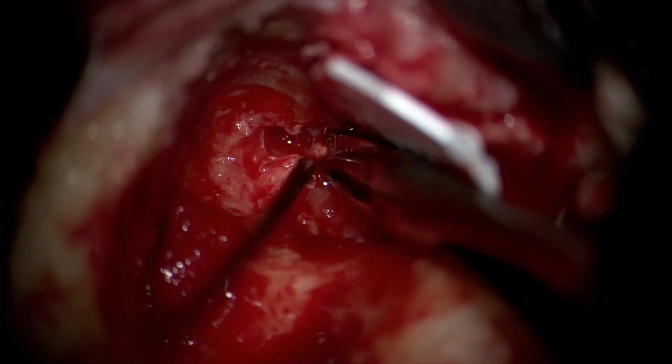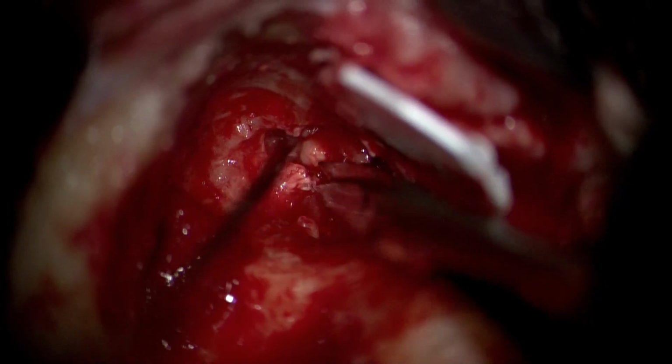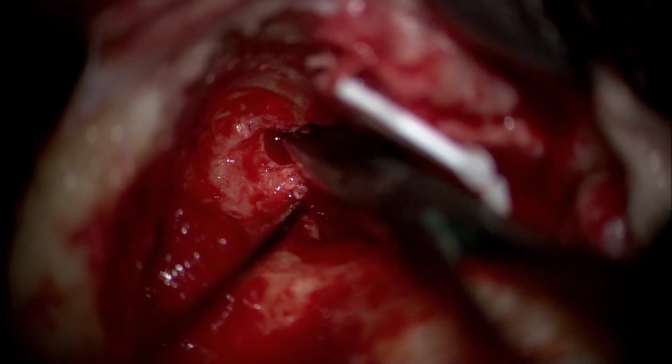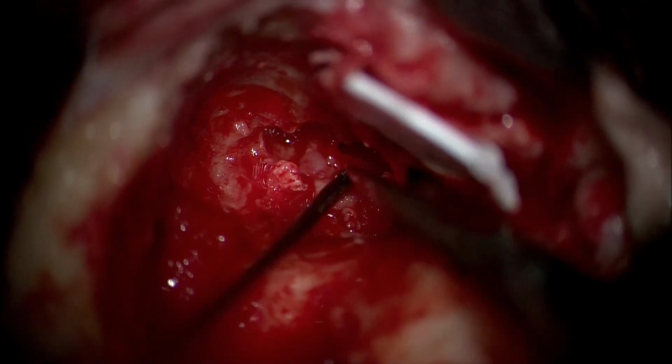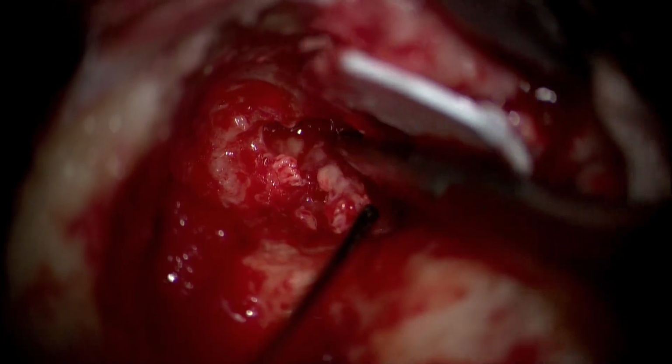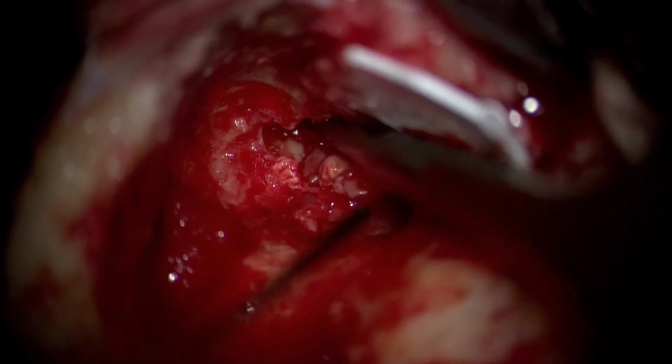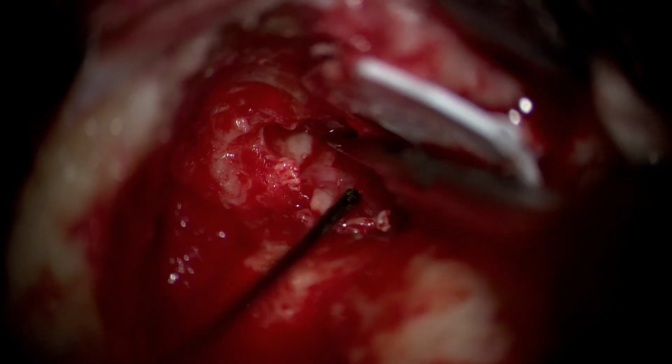Very often we see a lot of obsession, so to say, with the bony work in mastoids. And while that is important, equally or more important is the soft tissue work. In case the soft tissue work is incomplete, it often leads to poor outcomes after mastoid surgery, whether it is intact wall or canal wall down.